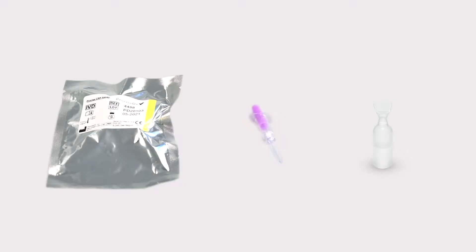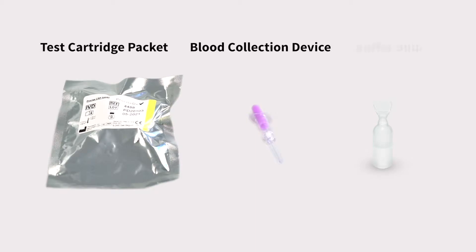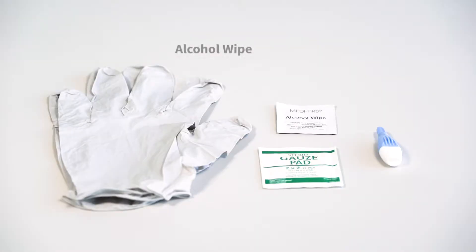The parts included with a Precise CRP assay are the test cartridge packet, blood collection device, and buffer bulb. Other items required are an alcohol wipe, clean gauze, lancet, and gloves.